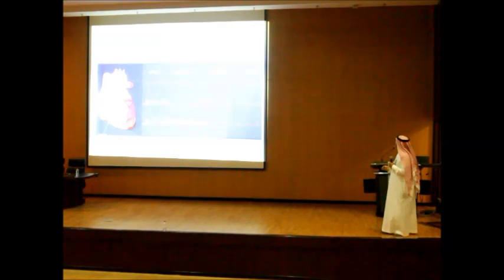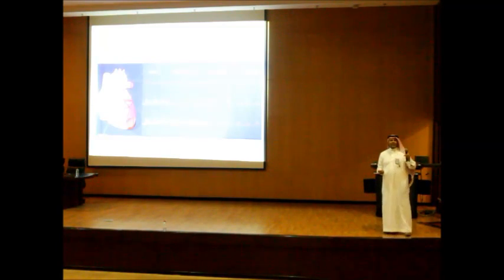Where? Lateral. Lateral, yes. You see the ST depression. This is reciprocal changes, right? So I can explain to you why you have reciprocal changes. Because the camera from the opposite side sees a mirror image.